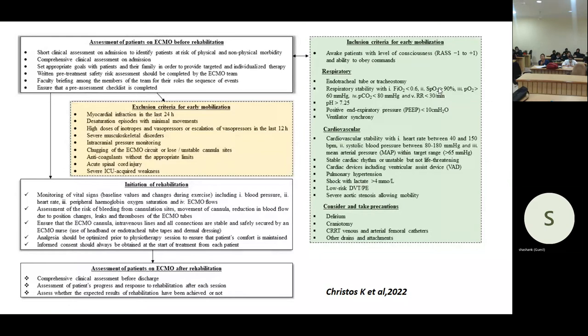Good. So, as we spoke about the history of management of patients with H1N1 influenza with only respiratory failure, a new concept has emerged as awake ECMO. Yes, sir. So this awake ECMO concept is very important for us. As the patient is awake, we can explain to them the importance of the exercises, and with that we can achieve the maximum level of rehabilitation from the patient. Clear? Yes, sir.